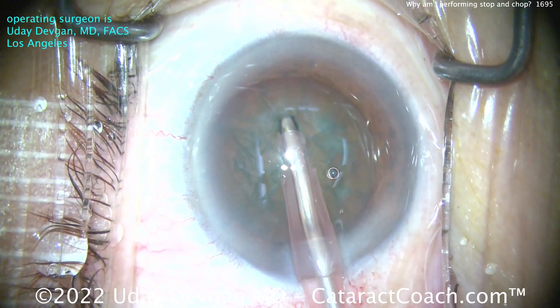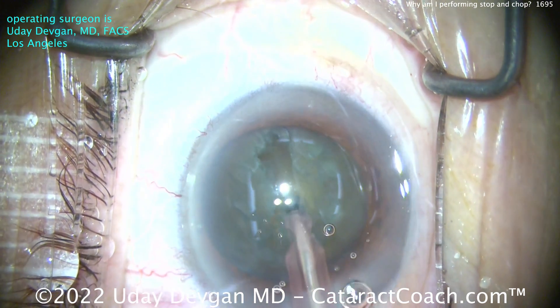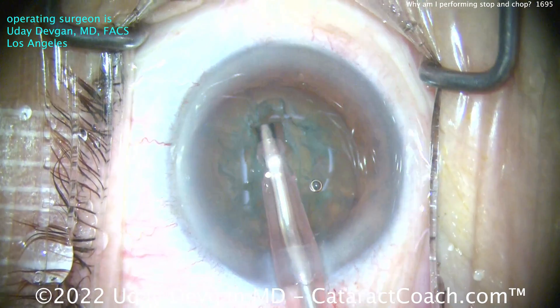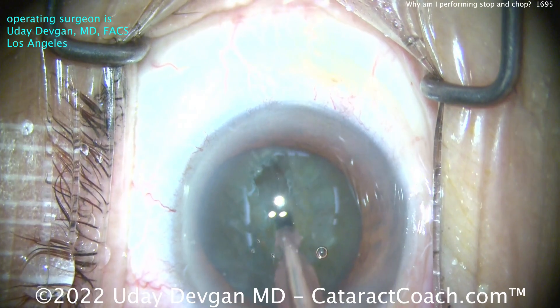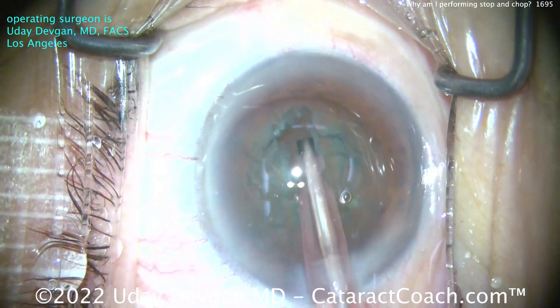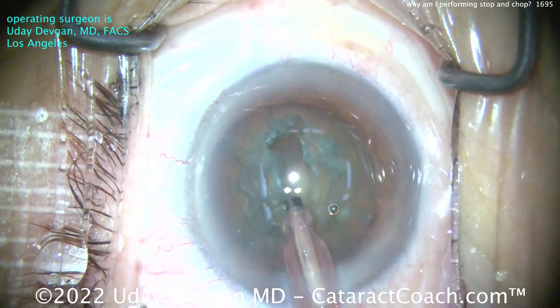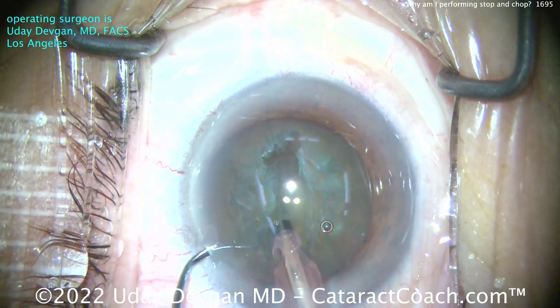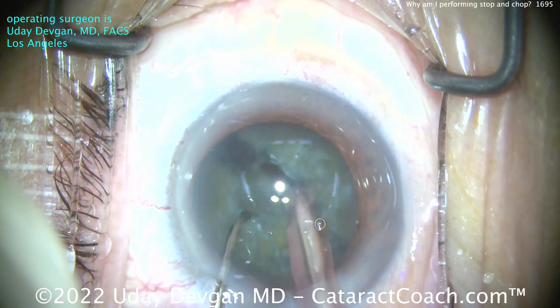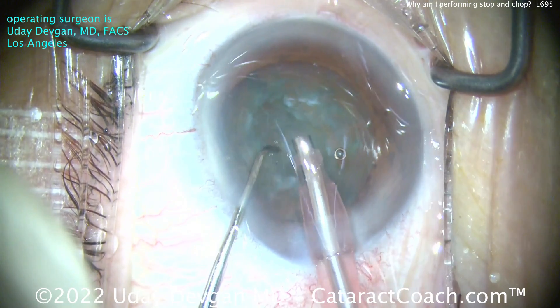Let's get a groove going. I'm sculpting a central groove here, and notice how I make the groove double width — I widen the groove right off the bat. It's not just one tip wide; it's as wide as two tips. Why? To debulk the central nucleus more. I want to take out about 15 to 20% of the nucleus through that groove, so the remaining nucleus is going to be smaller — each half is less than 50%. Now I can split it. Propagate that chop all the way through. Got two halves.